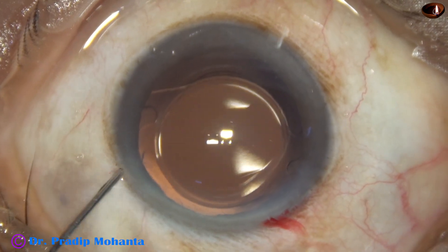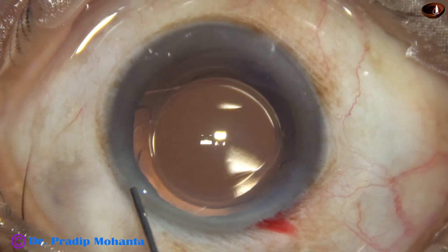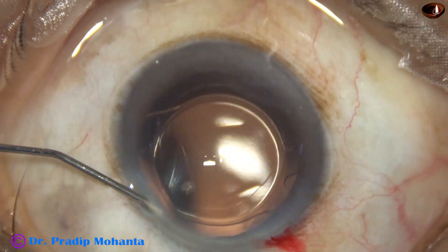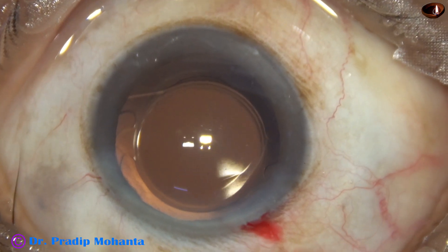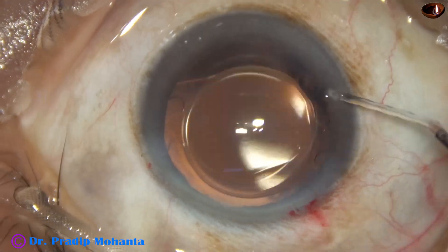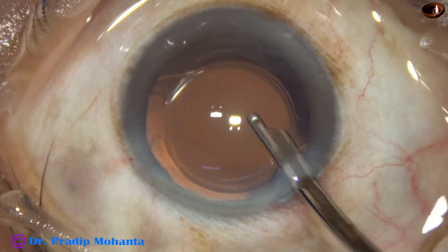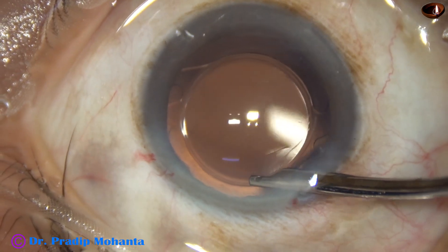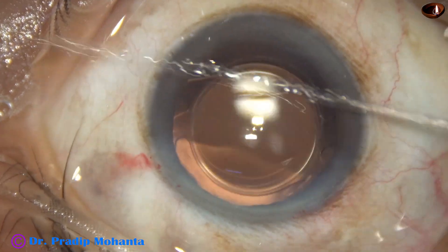Then a bit of moxifloxacin is applied, and the side port is closed — only one side port was used. If we use bimanual irrigation-aspiration, we need 2 side ports. Now this is the final lavage of the anterior chamber; the anterior chamber is lavaged and formed nicely so that the intraocular pressure is on the higher side.